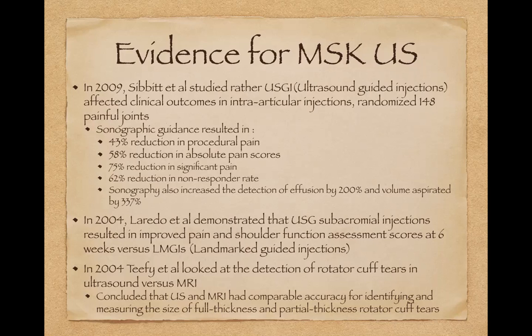which, you know, can have some placebo effect. The more of a show we put on, the more it seems like the patients actually are helped. But the last one: sonography also increased the detection of effusion by 200% and volume aspirated by 337%. You just can't beat actually seeing an effusion and being able to drain it.